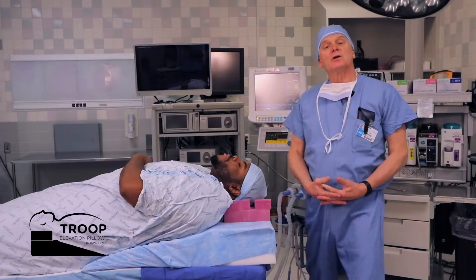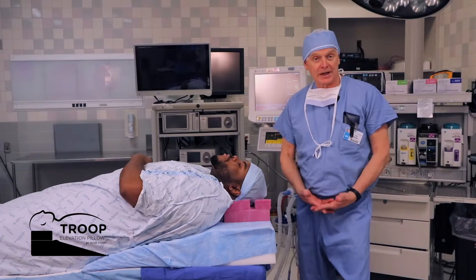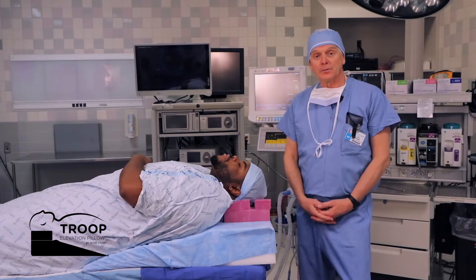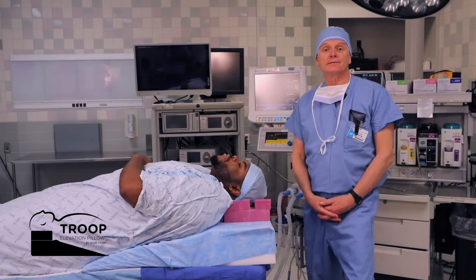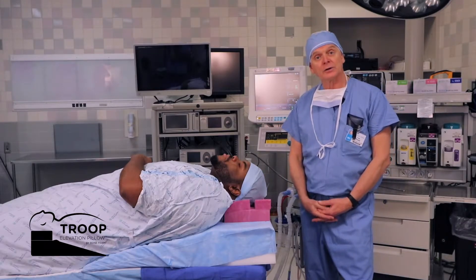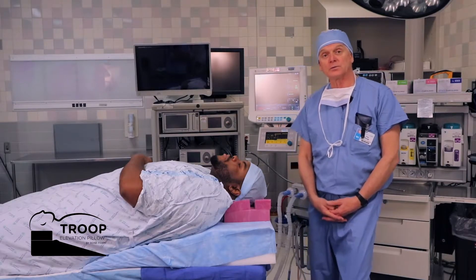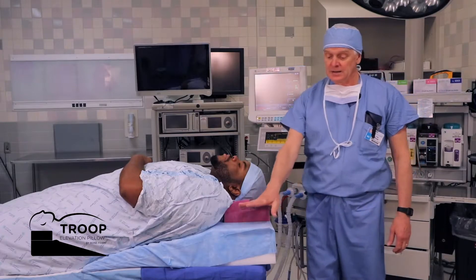What we've created is an alternative to a ramp made from several blankets. It's known as the Troop Elevation Pillow. It's currently in five anesthesia textbooks, numerous articles both national and international, and is being sold around the world and has been sold around the world for many, many years.